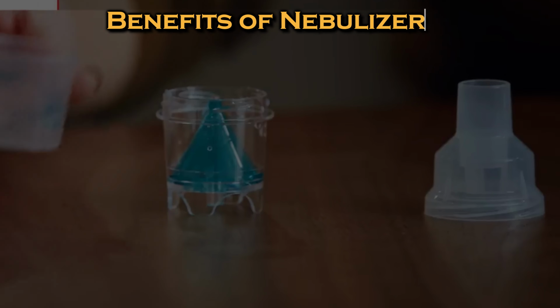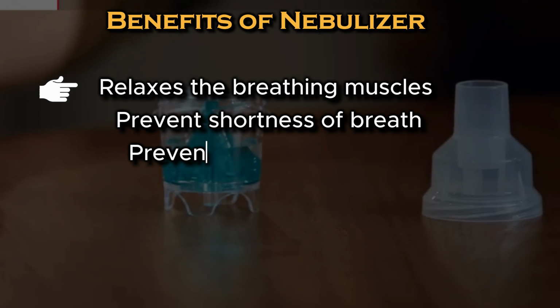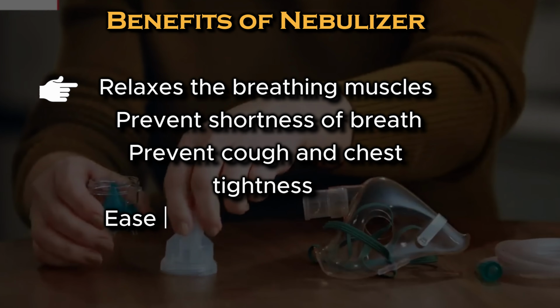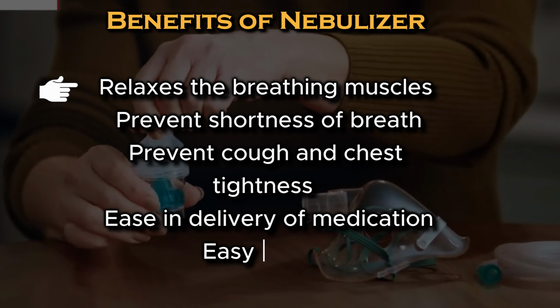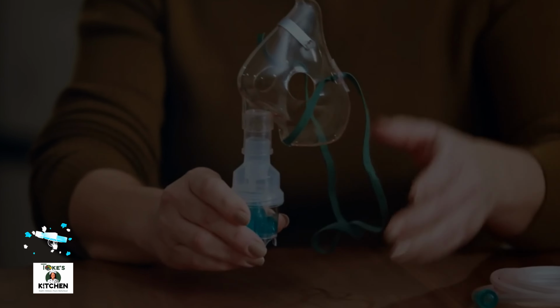Benefits of nebulizer: relaxes the breathing muscles, prevents shortness of breath, prevents cough and chest tightness, eases delivery of medication, easy to use, can be preventative.